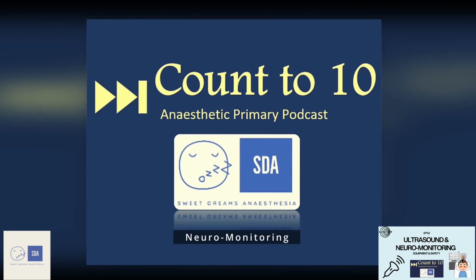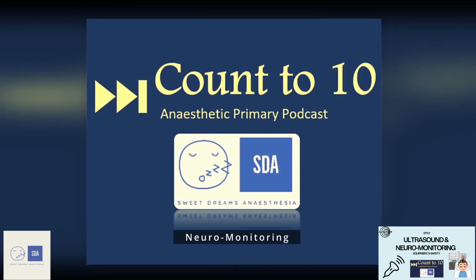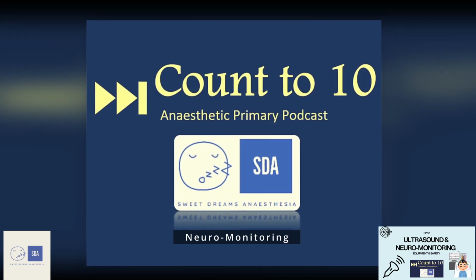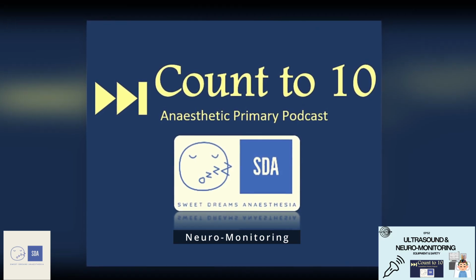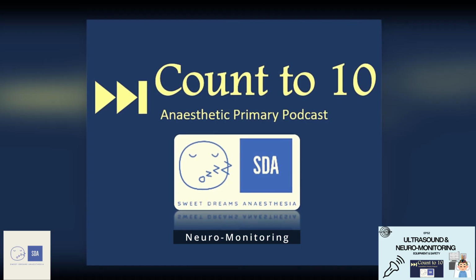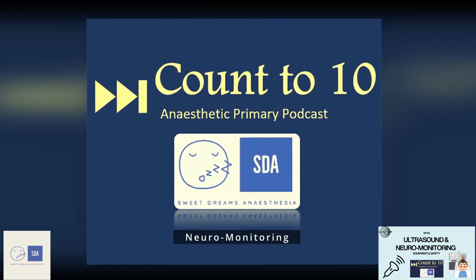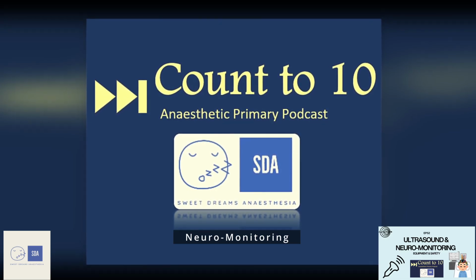And by displaying both the trends for the left hand side and right hand side, you can see whether there is symmetry between the different hemispheres or asymmetry, which might allude to earlier detection of problems in oxygen delivery and supply to the brain. Additionally, on this DSA, you can also see the representation of burst suppression as singular vertical black lines which stand out across that color scheme.